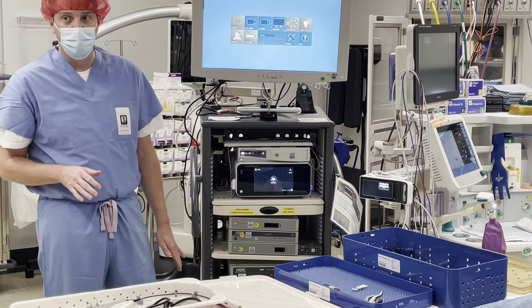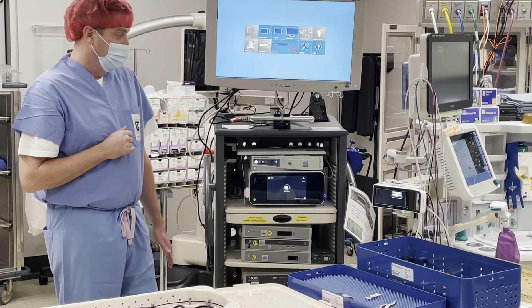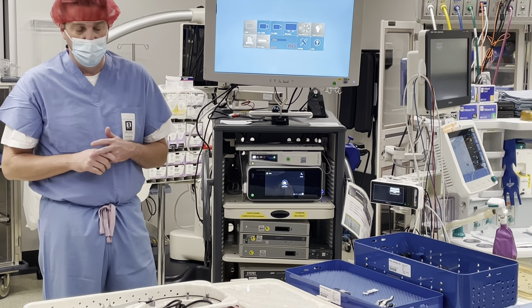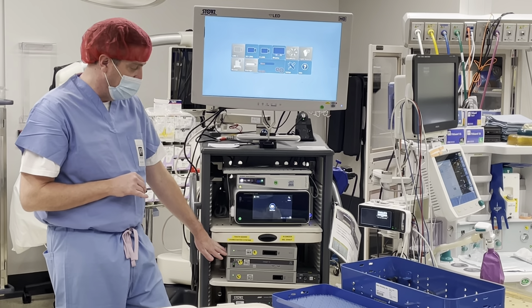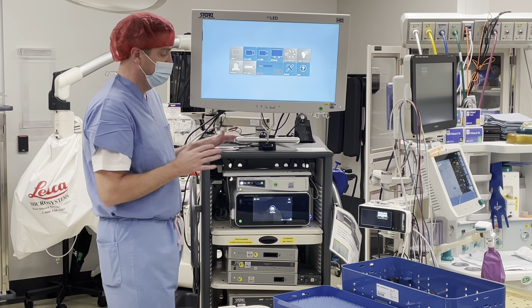So if I plug this in right now, it's not going to give me an image — which is what happened in the case last week. You're thinking, 'Oh my gosh, it's broken, we just got it, there's a bunch of problems.' Unfortunately, the way our system is designed, you have to go in and change the display.